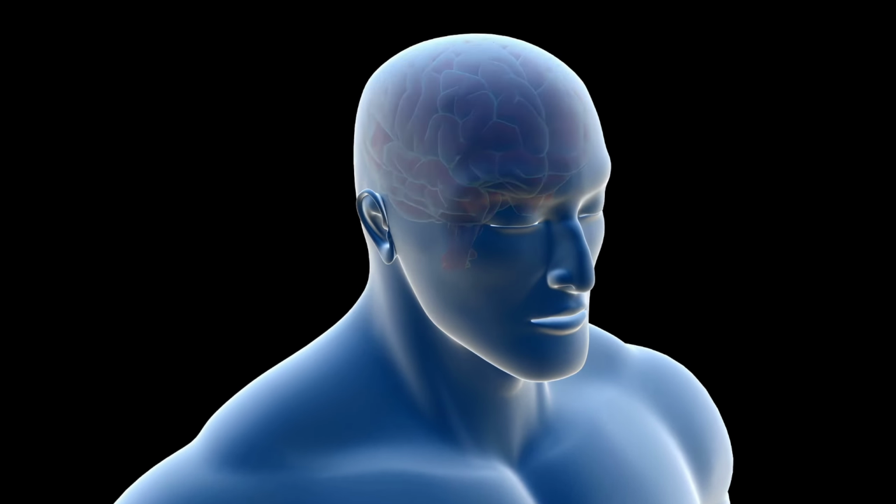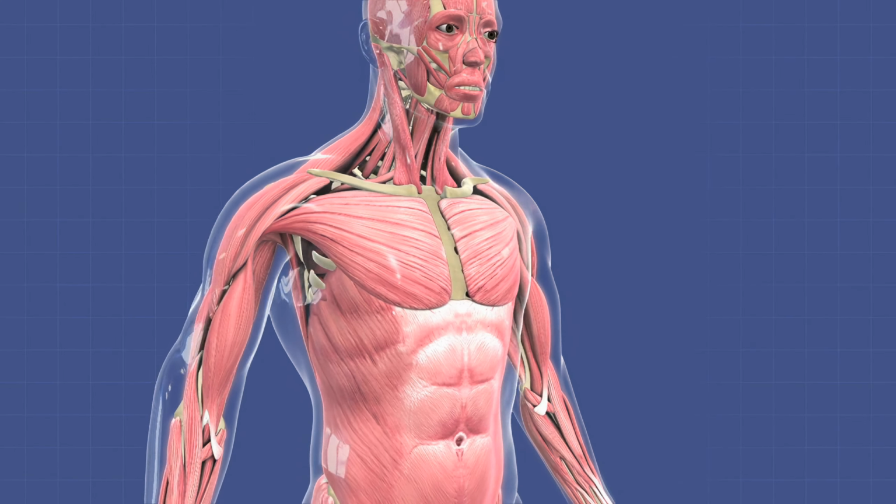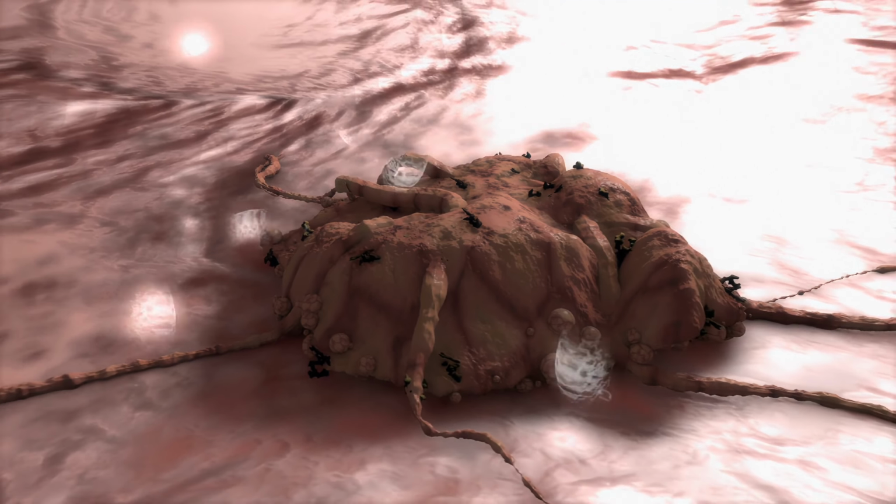There are also several anatomical locations where TENS electrodes should not be applied: over the eyes, transcerebrally, on the front of the neck, through the chest, using anterior and posterior electrode positions, on broken skin areas, or over a tumour. But is TENS actually effective?